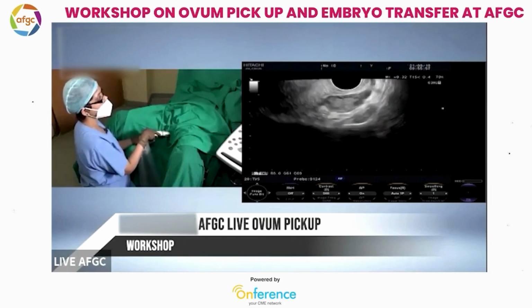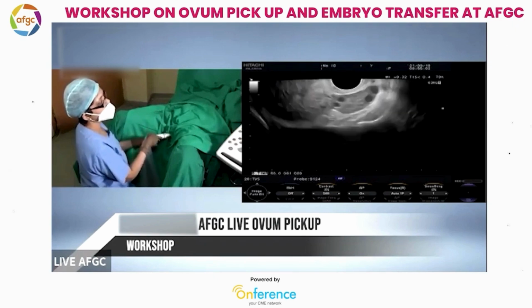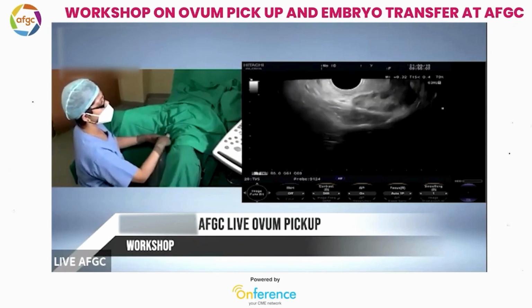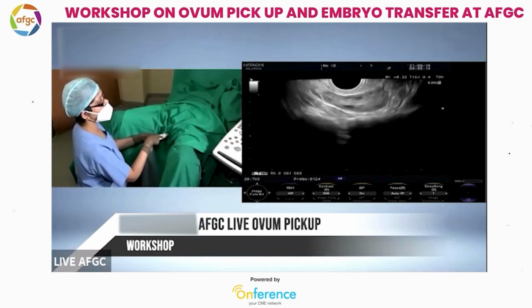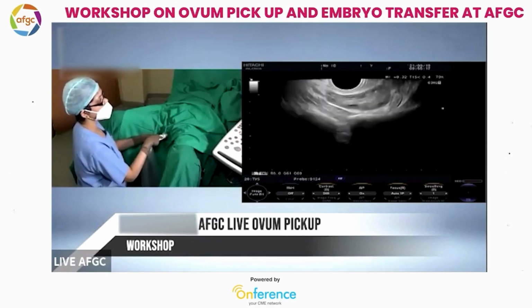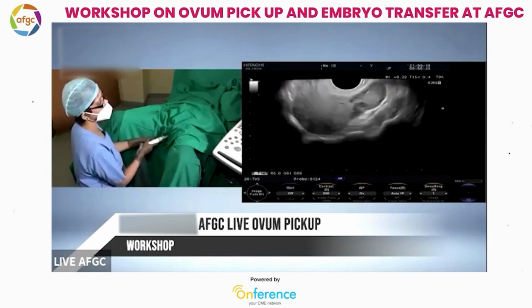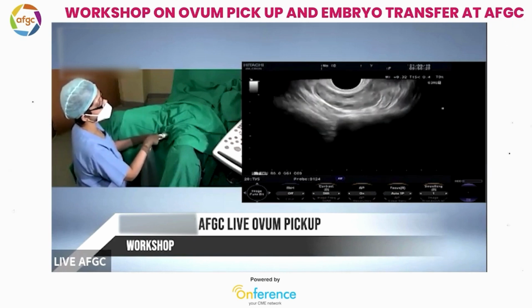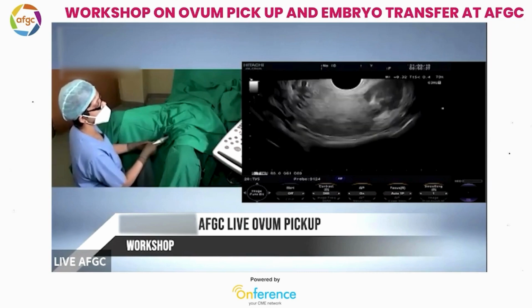So I am counting 1, 2, 3, 4, 5, 6, 7, about 8, 9, 10. I would not really categorize it as such, but here you can see a chain of cysts in the periphery. So maybe mildly polycystic, though there is no ultrasonic differentiation of mild, moderate and severe. It either has to be more than 10 on each side, and which I think we can see. And then again you scan through the endometrium to see whether you are missing anything or not.